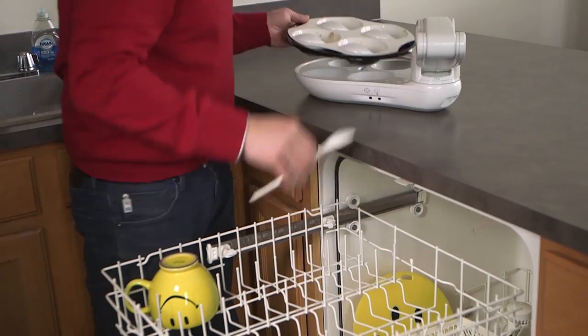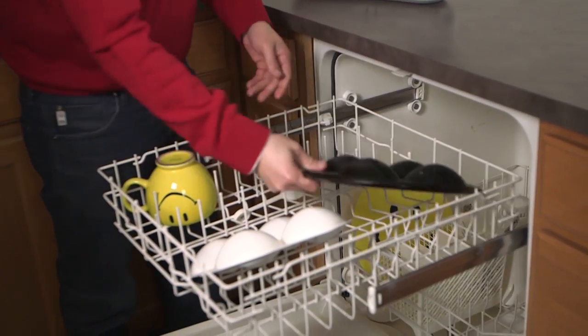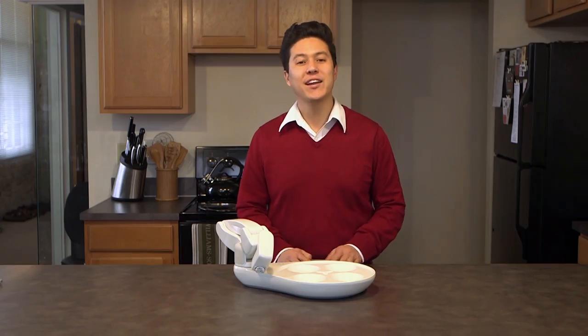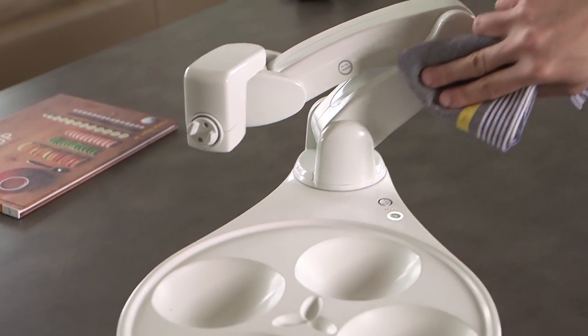Once a meal is complete, please take the dishwasher safe parts — the plate, placemat, and spoon — and place them in the top rack of your dishwasher. When necessary, please use a damp towel or disinfecting wipe to clean OB's base or arm.